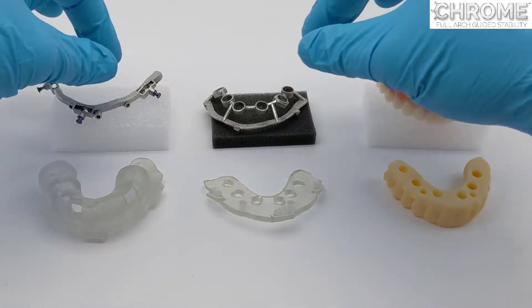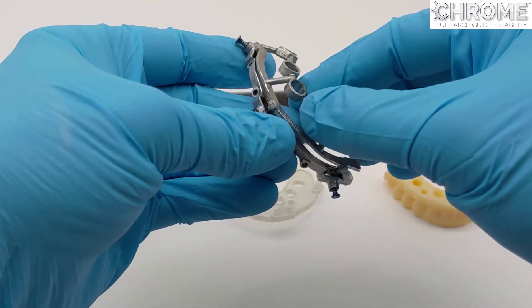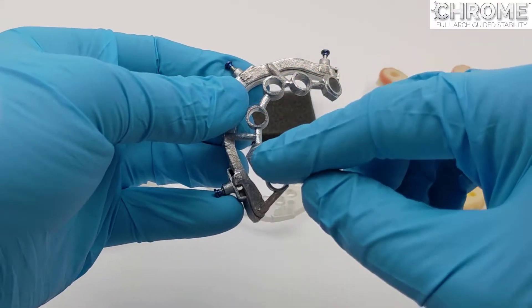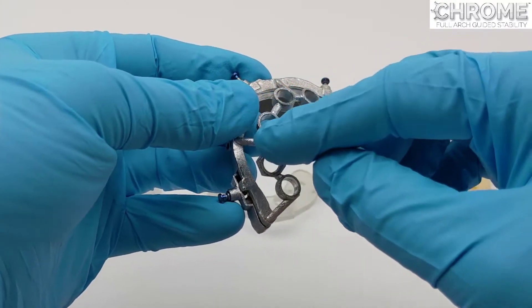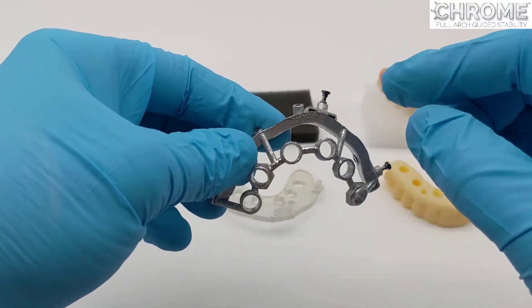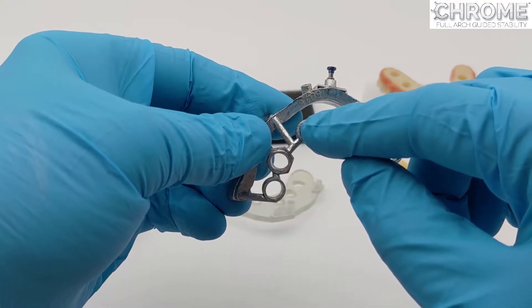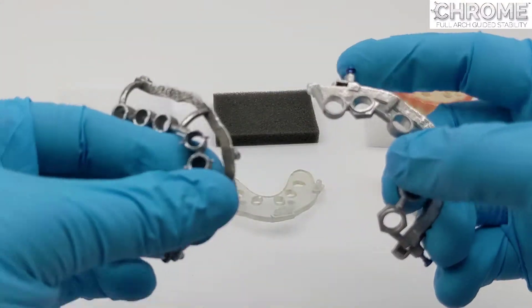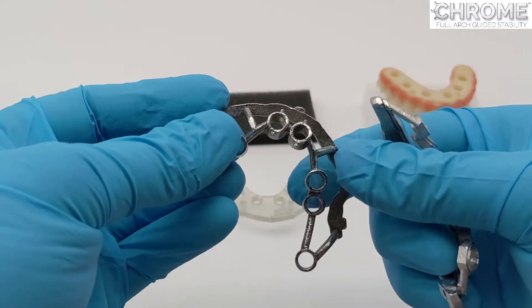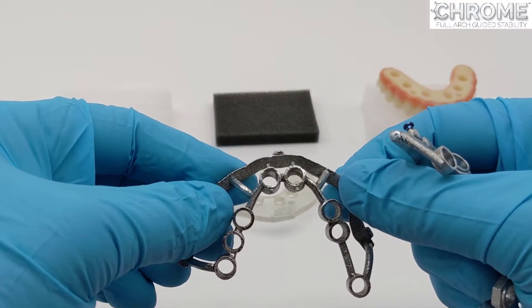The osteotomy guide is for creating the osteotomies and drilling the sites. It is made of chrome cobalt, just like the fixation base, and is custom made for many different guided kits. When they're just round with no geometry or nubs, they're for straight implants. When they have a geometry — like these little nubs here, visible on the buccal and the lingual — that is an indication for rotating the tool so it lines up with the hub or driver of the implant.